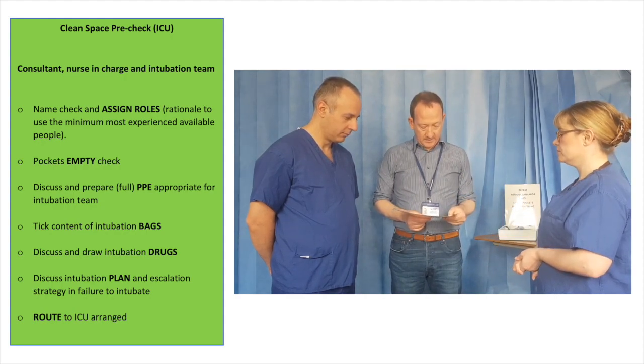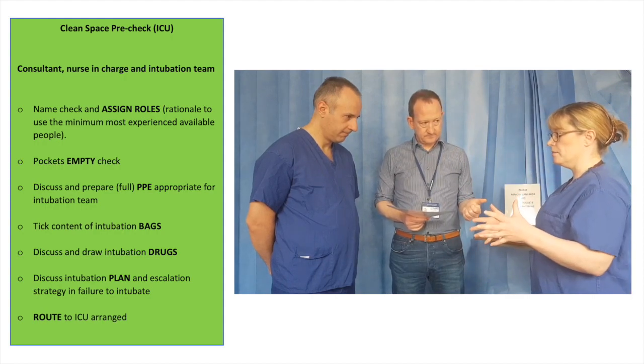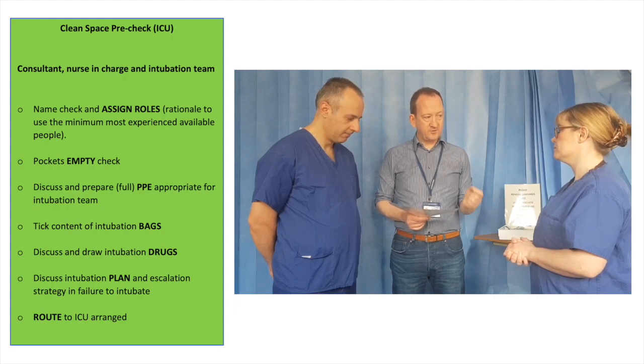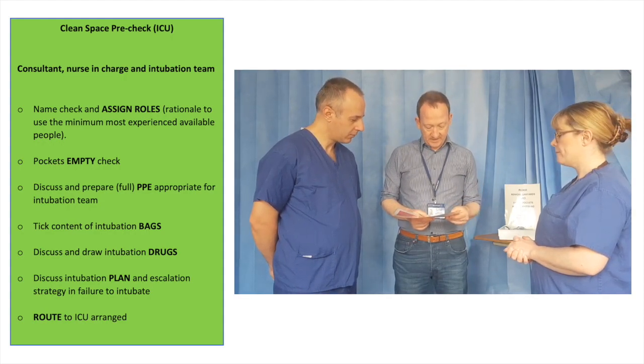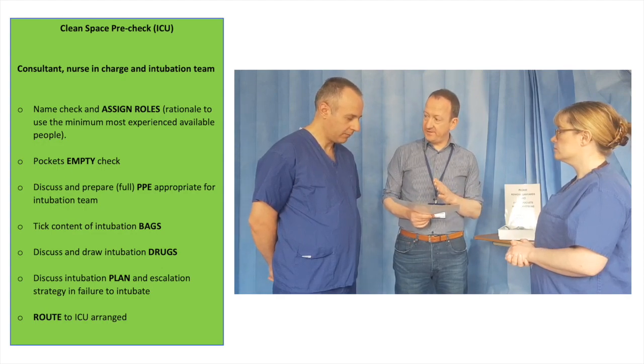Fantastic. Have we checked the intubation boxes? Yeah, so they have all been checked and tagged this morning, so we don't need to do a second check. And drugs were drawn up today? I did, yeah. I draw up the drugs that I need for that patient. And they're all labelled appropriately? Yes. Fantastic. So we have been through this in simulation, we have an intubation plan and an escalation strategy. Yeah. It's very clear about that?